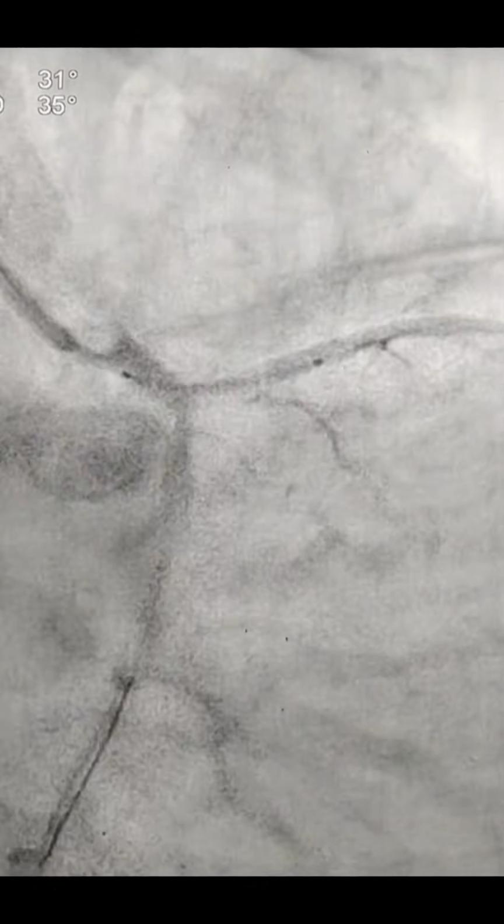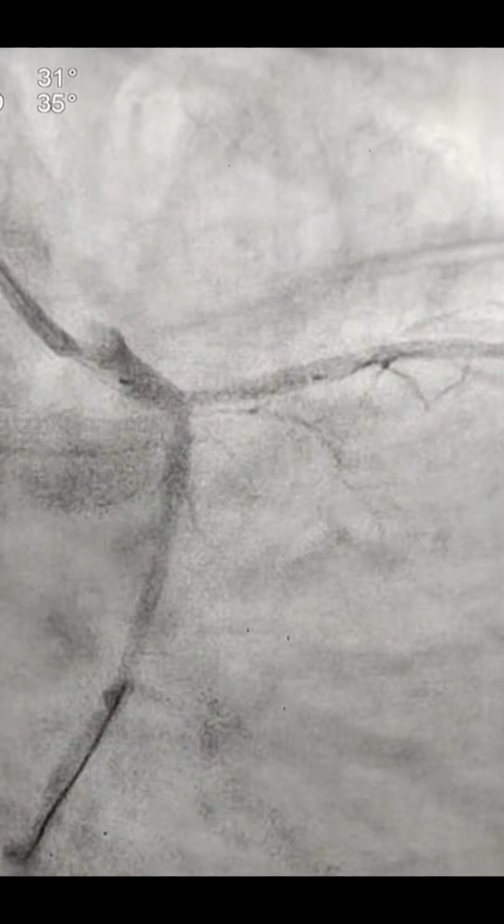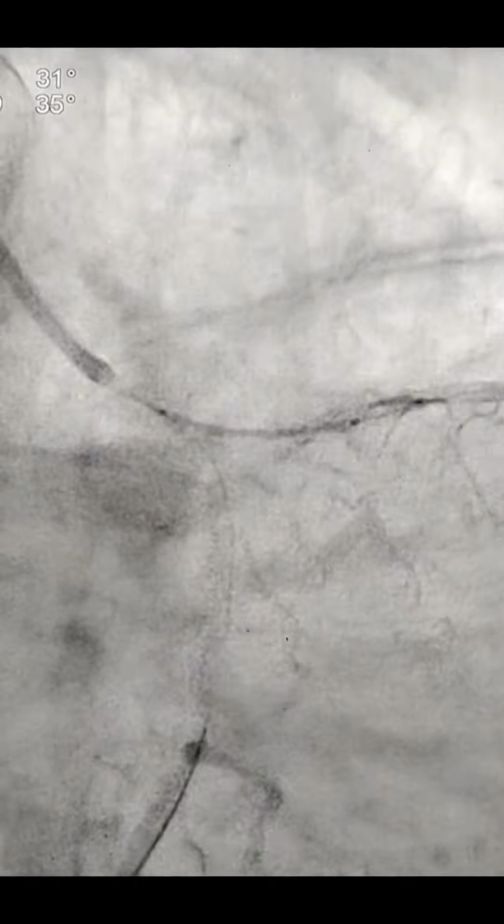And this is provisional stenting we are doing. If LCX gets compromised, then we will intervene. Otherwise, we will not intervene in the LCX, because there was no significant lesion at the ostium of LCX. In the proximal LCX, there was a mild lesion. So this was the strategy.